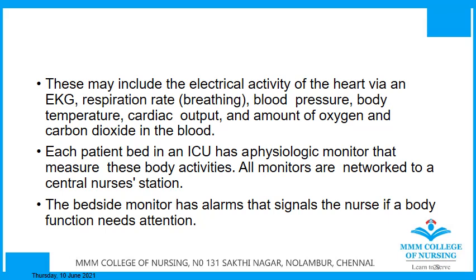So each patient bed in an ICU has a physiologic monitor that measures these body activities. All the monitors are networked to a central nurses station in a common computer. The bedside monitor has alarms that signal the nurse if a body function needs quick attention.